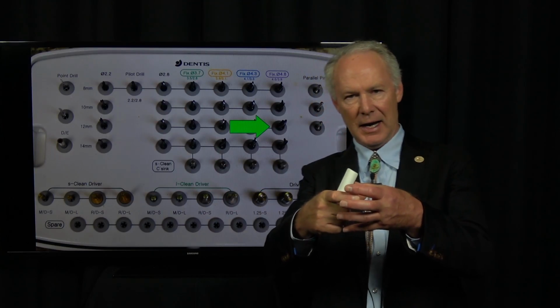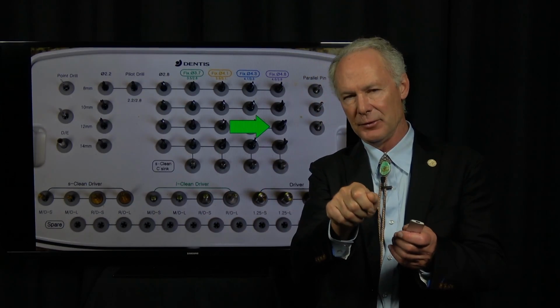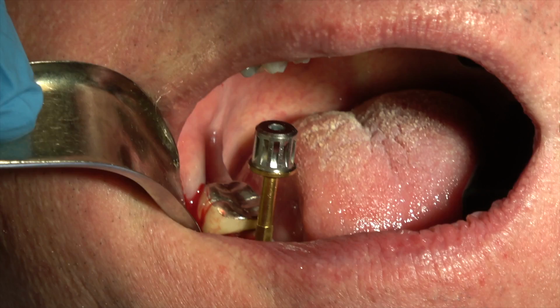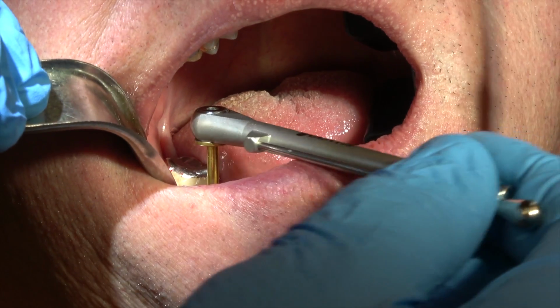You want it to be tight, but say you got 25 and it was really tight. You'll be fine because it's going to heal for 3 months before you load it, and that last little bit of bone will grow into or osseointegrate with the implant, so you'll be fine. And you'll be able to finger tighten it to a point and then have to use your ratchet wrench.